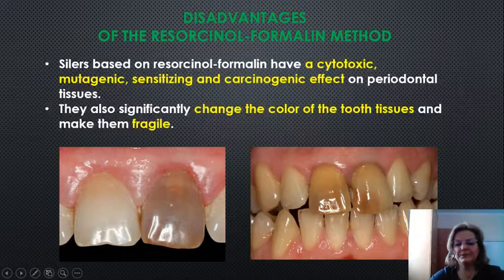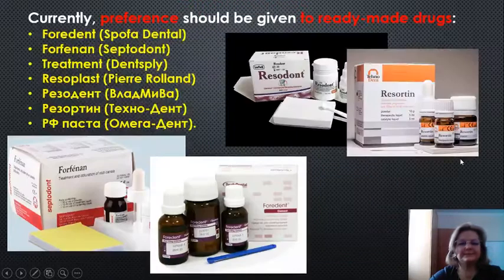You see in the picture the change in color of the tooth tissues after resorcinol-formalin paste. Currently, preference shall be given to ready-made drugs.